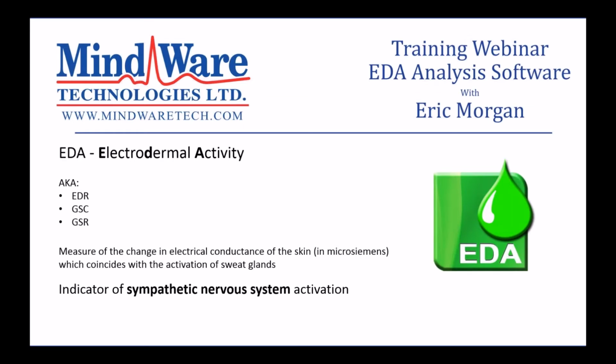And studies have shown that EDA is a good indicator of sympathetic nervous system activation. So when we see changes in the electrical conductance of the skin, we can correlate that to changes in the sympathetic nervous system. So we can really gain insight into the emotional state of a subject following the presentation of some stimuli.